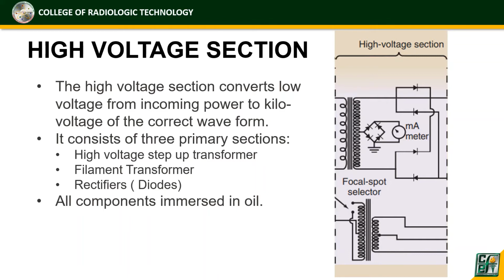Okay, all components are immersed in oil. Okay, what is the function of oil? Oil serves as the insulator or insulating material. It helps in the dissipation of heat.